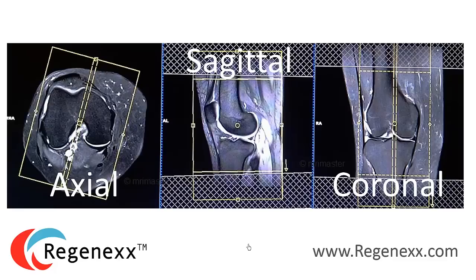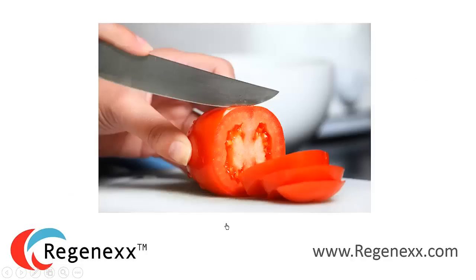For a knee MRI, an axial view would look like this on the left, a sagittal view like this, and a coronal view like that — so top-down on axial, sagittal from the side, coronal from the front. As you look through an MRI, you have to understand that you're looking at slices of an image, looking from front to back or left to right, marching across the structure slice by slice.